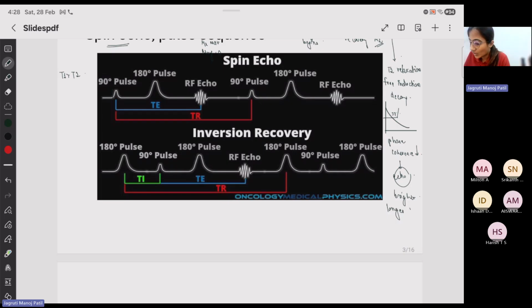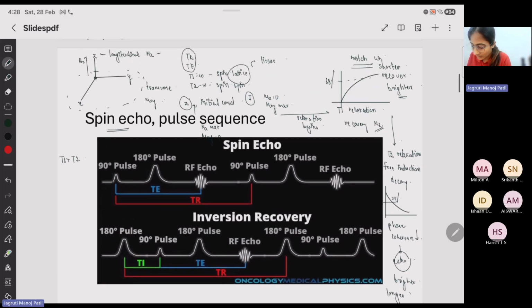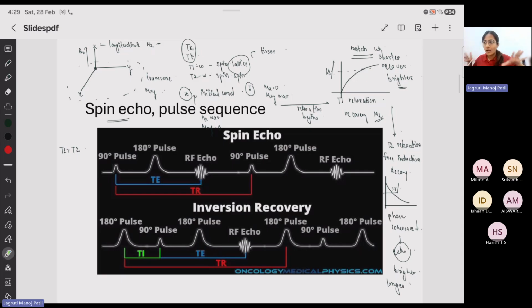Okay. Now, what is this 180-degree pulse here? This 180-degree pulse was applied so that we have everything in this particular axis again. Since this 90-degree pulse was applied, now they all are here. Again, 180 degrees applied, because they themselves have a natural tendency to align with the inherent magnetic field being applied. But this is a conventional form of spin echo, which is not at all preferred because you don't want the patient to be constantly under a magnetic field. Of course, magnetism does not cause you anything, it's a non-ionizing form of radiation, but it's not good for our cells to go through this constant 1 Tesla of magnetic field throughout our body.